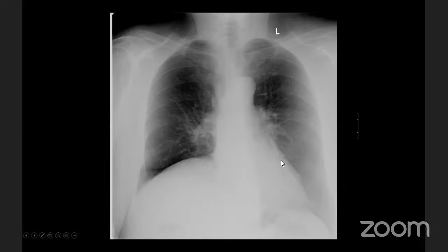One thing is that yes, this lung field is definitely whiter than this one, and there is one problem, because sometimes when there is a problem with something which is just darker, and the pathology is darker, usually I think that the darker thing is actually healthy and the whiter is unhealthy. In this case, this is a healthy lung, and the problem is on this side. And I can tell you why.